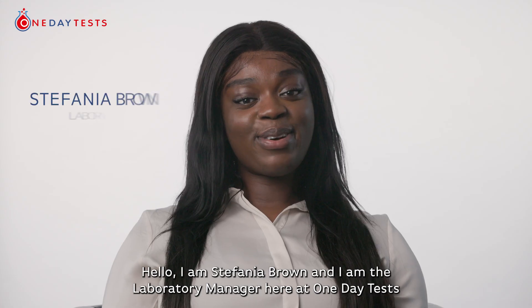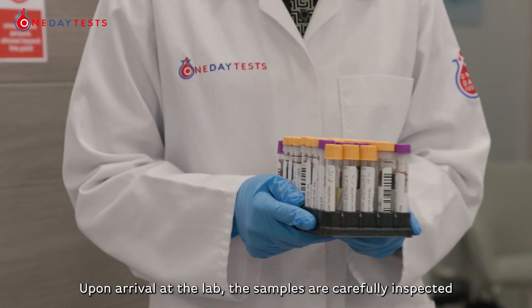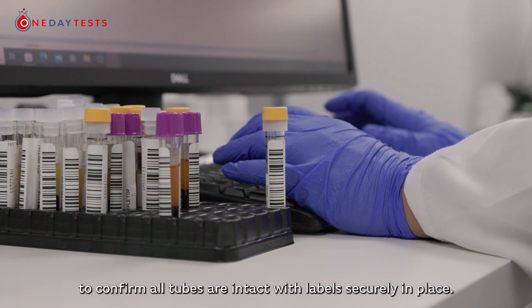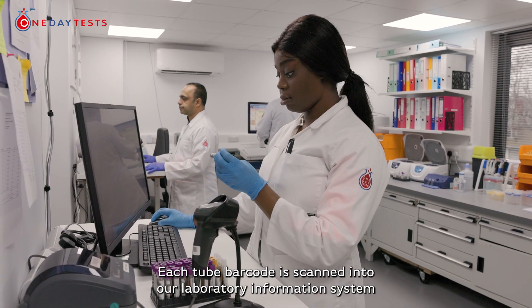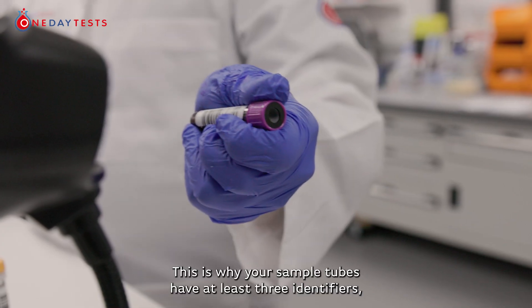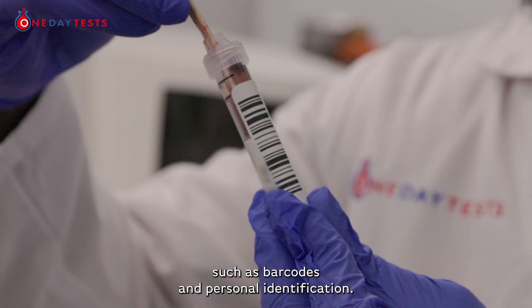Hello, I am Stefania Brown and I am the Laboratory Manager here at One Day Tests. Upon arrival at the lab, the samples are carefully inspected to confirm all tubes are intact with labels securely in place. Each tube barcode is scanned into our laboratory information system and any discrepancies are cross-checked. This is why your sample tubes have at least three identifiers, such as barcodes and personal identification.